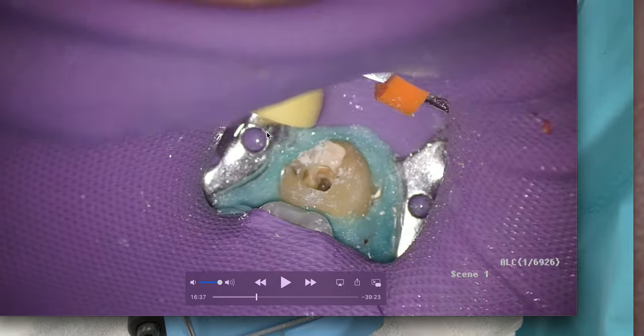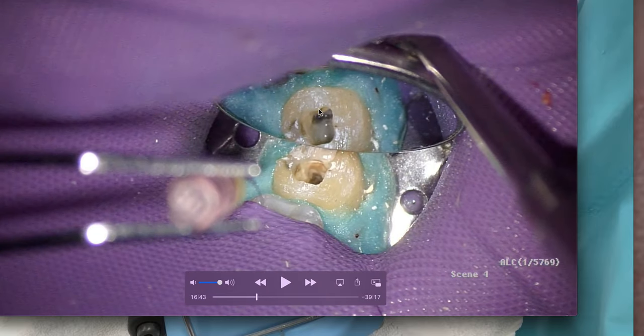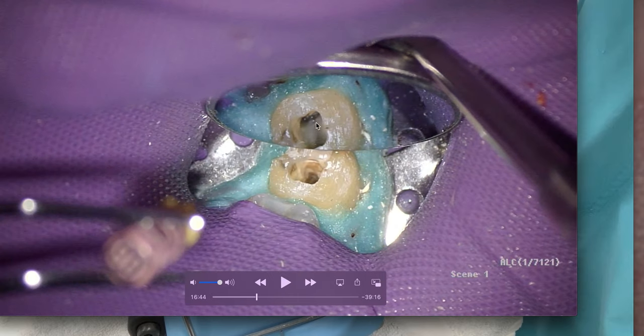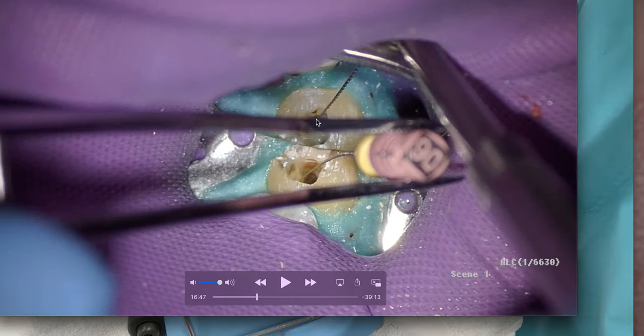Now I've troughed between the two mesial canals. There is no extra canal — there's no white line or white dot indicating a potential additional canal.